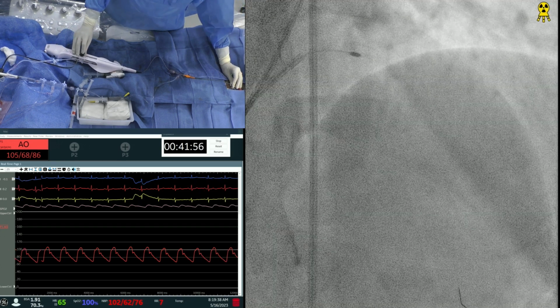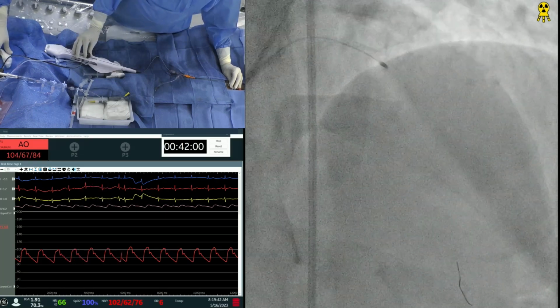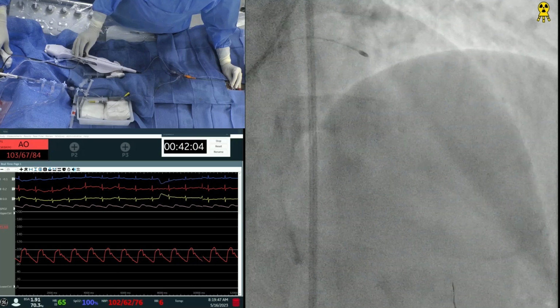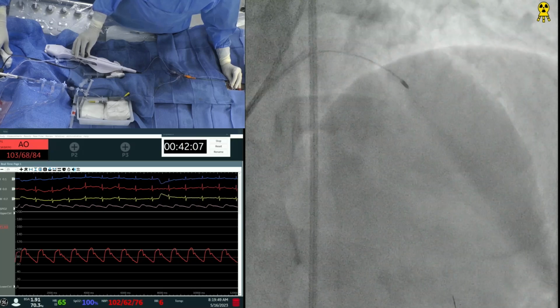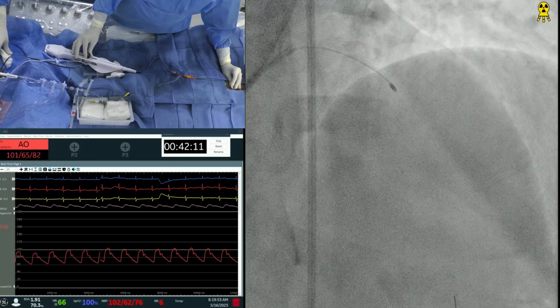So the question is, do we go, usually you go about 7 or 8 runs and then try, then downgrade it. Or you can go with a higher speed. Yeah, which went in. Okay, just cross. And polish, there we go. This segment first.